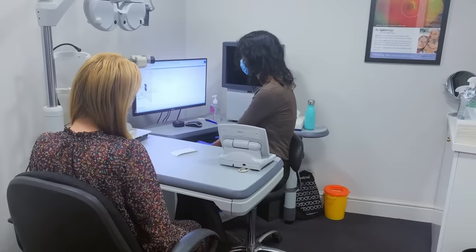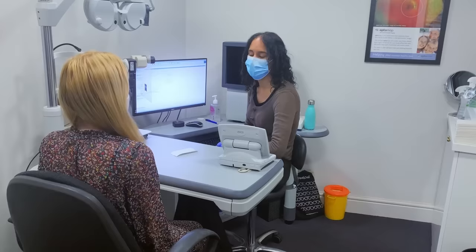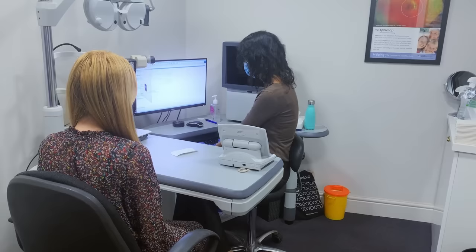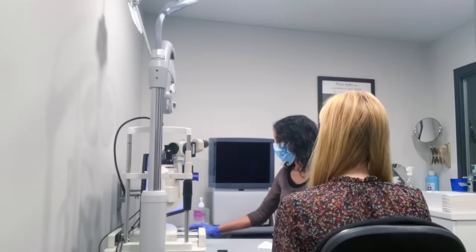And it sounds like a funny question, but when you get your headaches, is it more towards the front of your head or on the top or on the side? The front, yeah. Okay, fine. And do you notice any flashing lights or any black spots floating across your vision? Not that I can think of, no. Okay, good. And I'm presuming that you don't wear contact lenses? No, I don't. Fine.